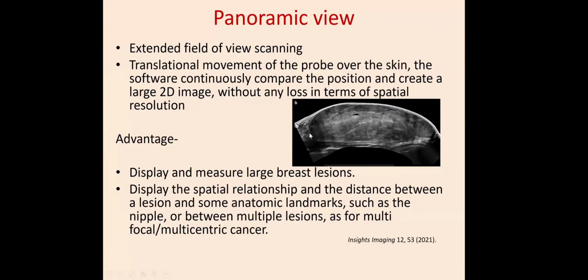So these are large lesions which you would not have been able to see even with the dual screen, but with panoramic view you can nicely see them. And what is the advantage of this panoramic view? It displays and measures large lesions and displays the spatial relationship and the distance between the lesion and some anatomical landmarks such as the nipple. You can measure distance from the nipple.